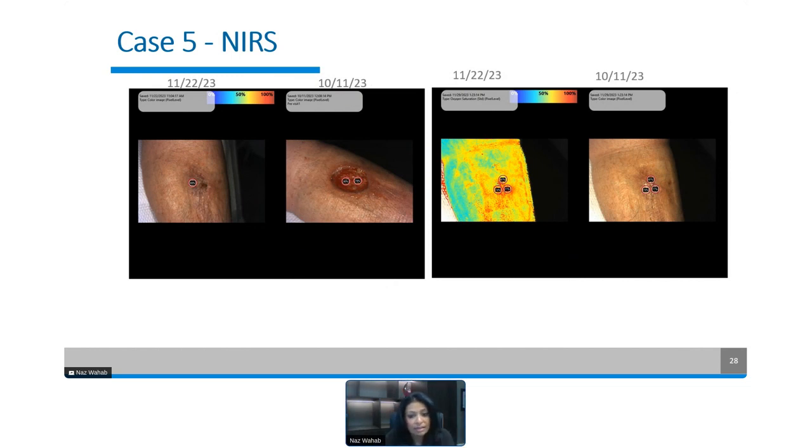And so that continuum of care and continuum of what's happening in that wound bed should not be neglected or taken for granted either, and we should continue our therapy despite our naked eye thinking that this is actually healed or closed.